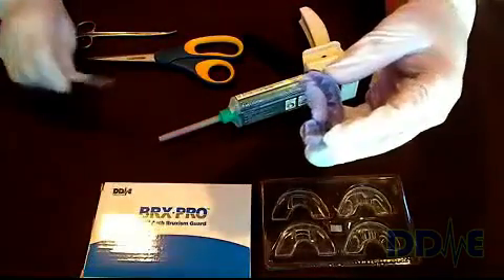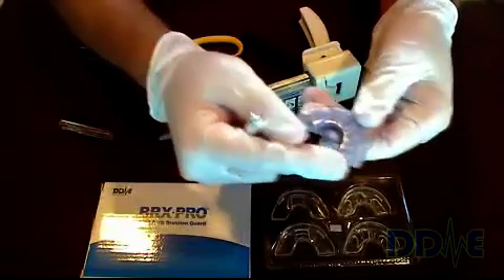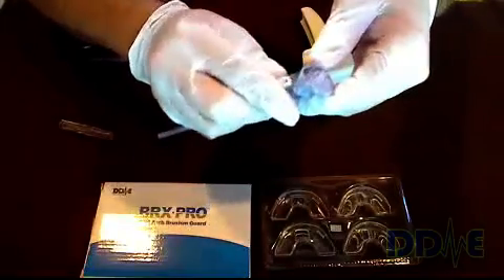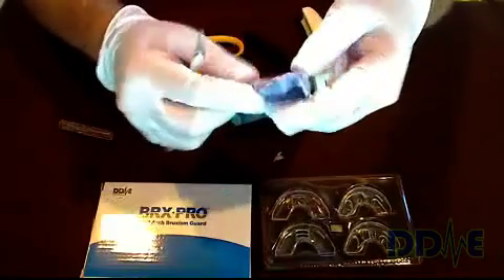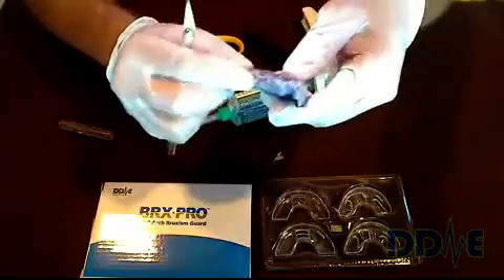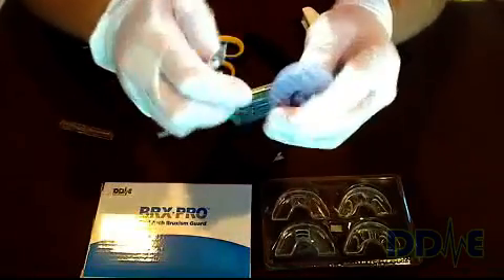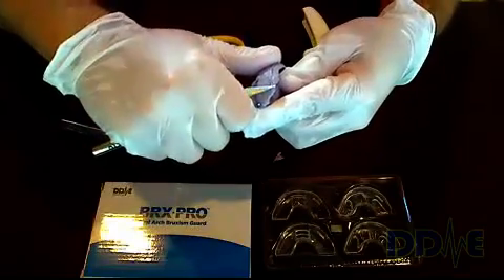The first step is to take off the back edge material on the impression tray, being careful to cut along the impression tray. One of the nice things is that you can use the tray as a cutting guide. The other part of the tray you often have to trim is the front edge and the sides.